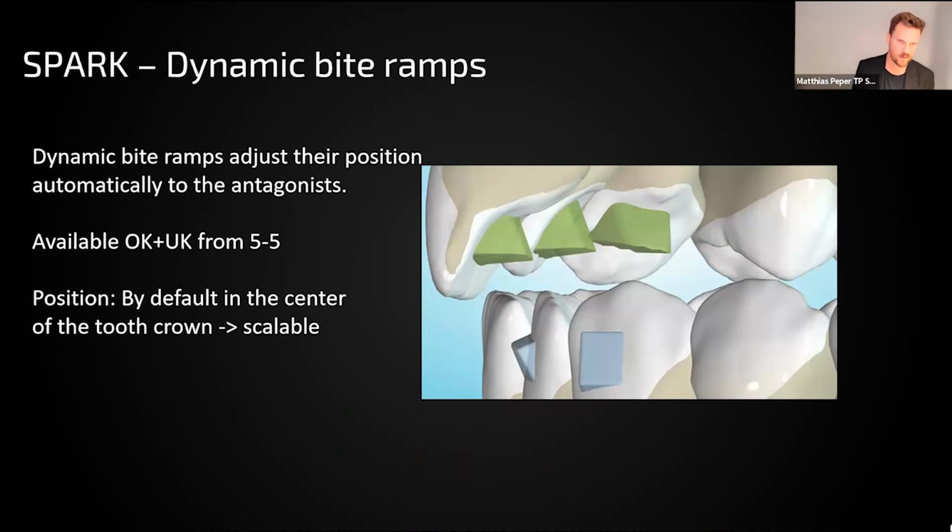And that helps us very often because in a lot of cases, if the overjet is too huge, we are not really able to use the bite ramps. And then, for example, for Invisalign, we always need to place occlusal attachments in the area of 4 and 5.